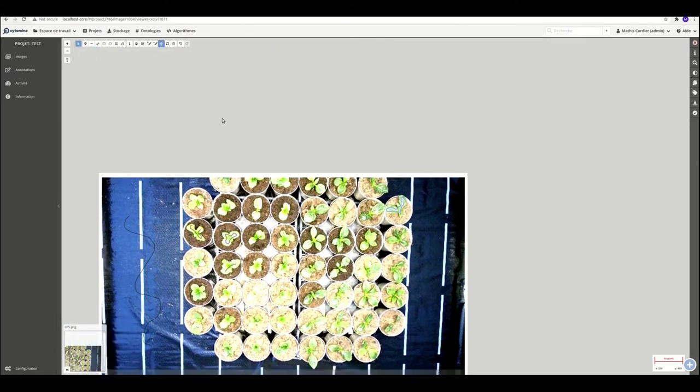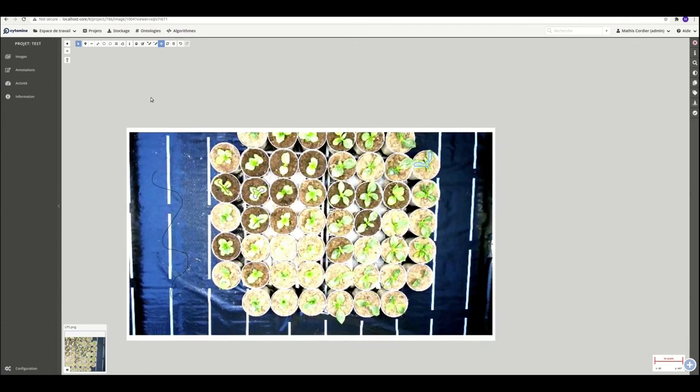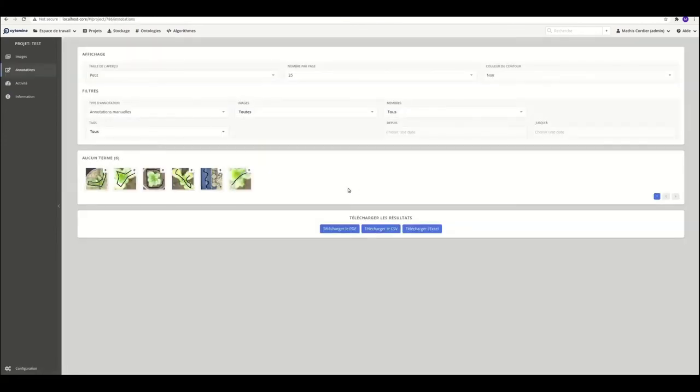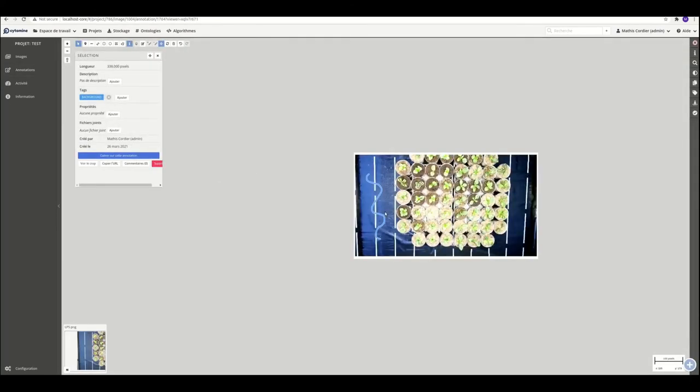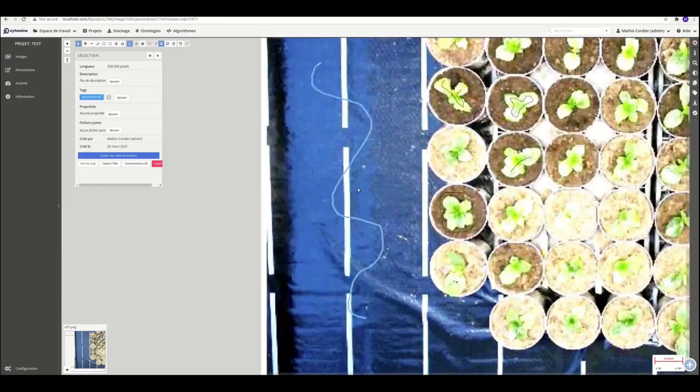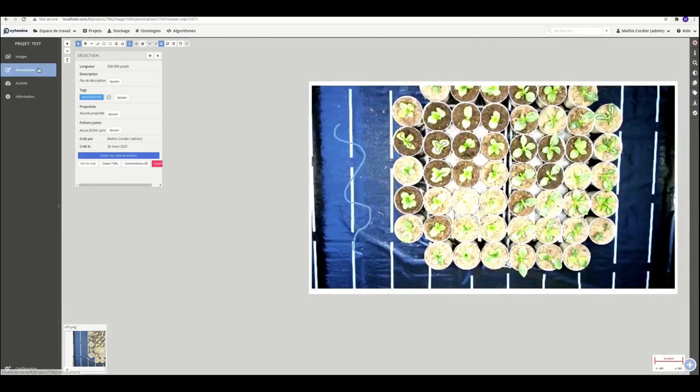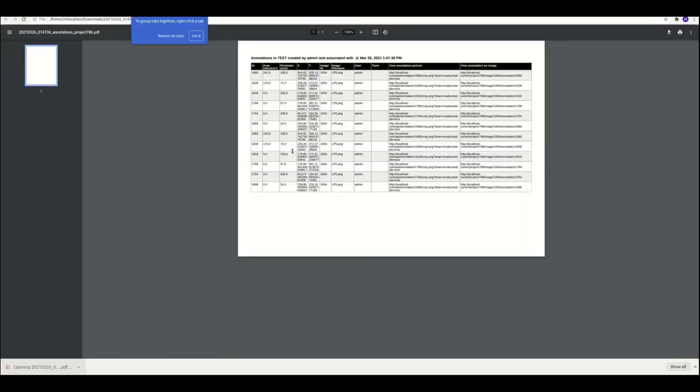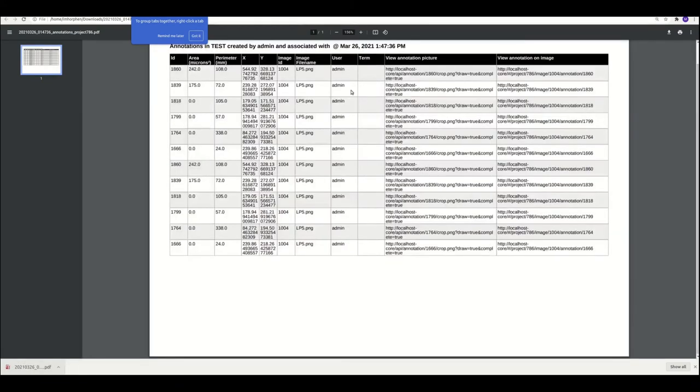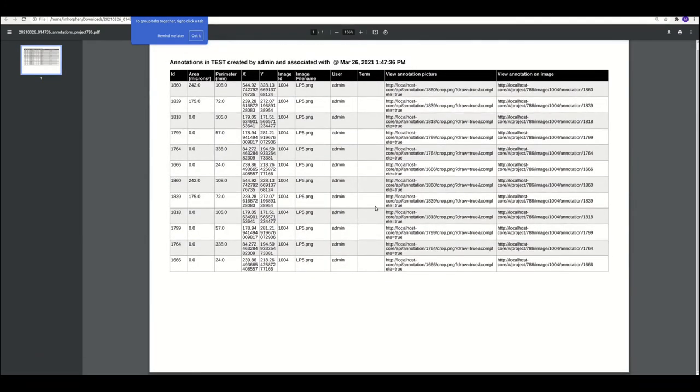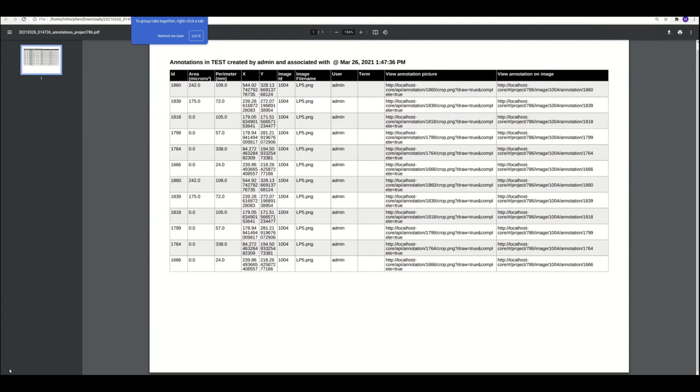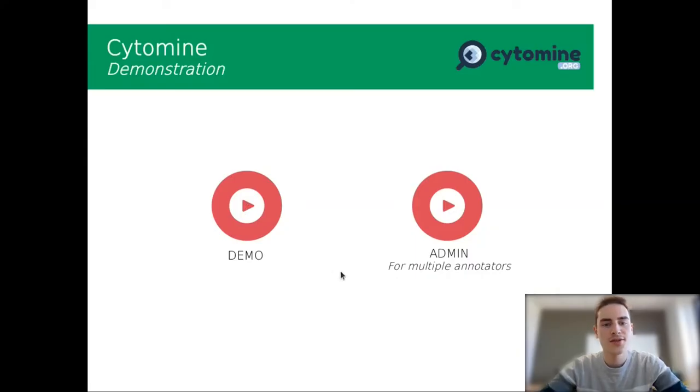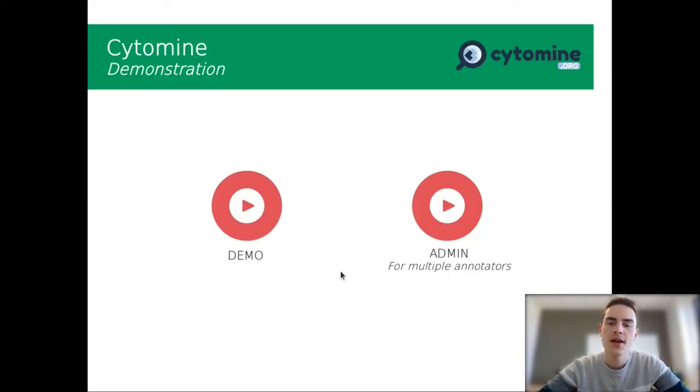So you have all the tools on the top left-hand corner. And you have all your annotations here in the annotation panel. You can also modify it. And you can also download it as CSV, Excel, or PDF file. Here we have the PDF file. So I'm the admin user, etc. You can see all the metadata corresponding to your annotations. And you can download it as CSV or tables. So that was all for the demonstration of Cytomine.